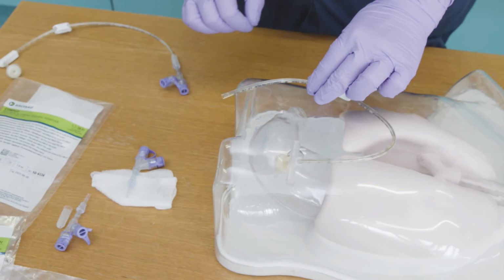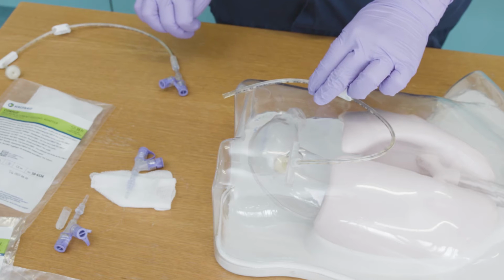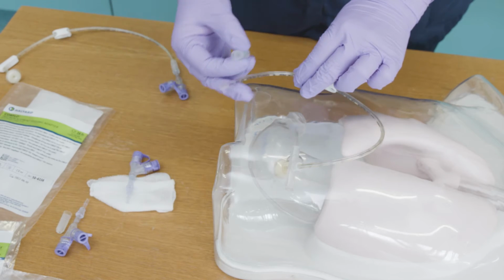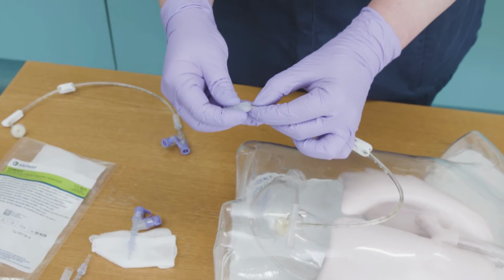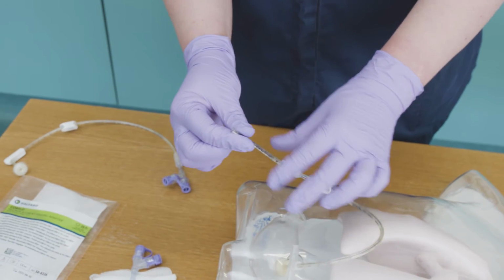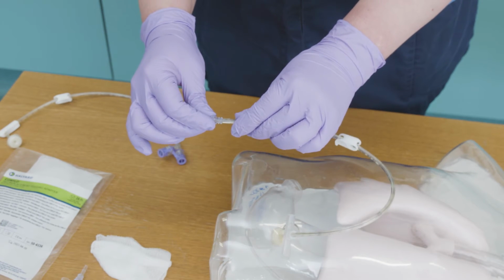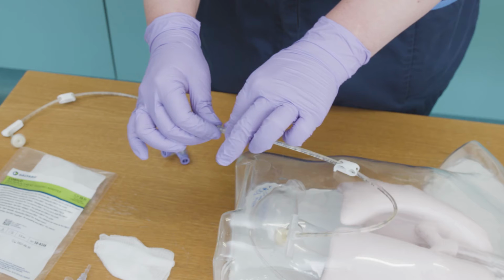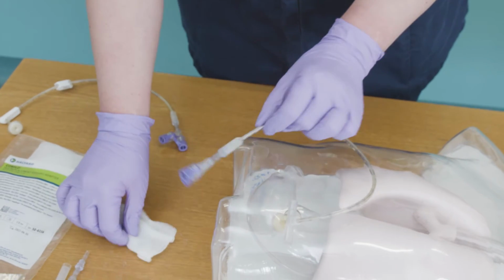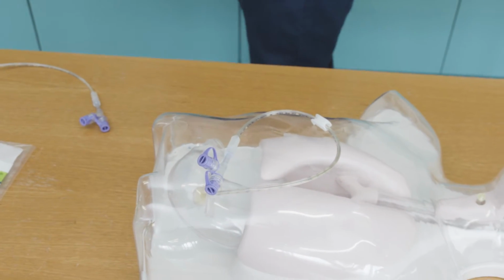If the tube is stretched at the end of the PEG tube, cut approximately 0.5 centimetre off the tube with clean scissors. Put the PEG tube through the narrow end of the new skirt. Push the hard part of the Y adapter into the PEG tube until the tube stops. Twist the skirt onto the Y adapter until the stop is reached. Dispose of the old Y adapter and gloves and apron, if used, and then wash your hands for 20 seconds.